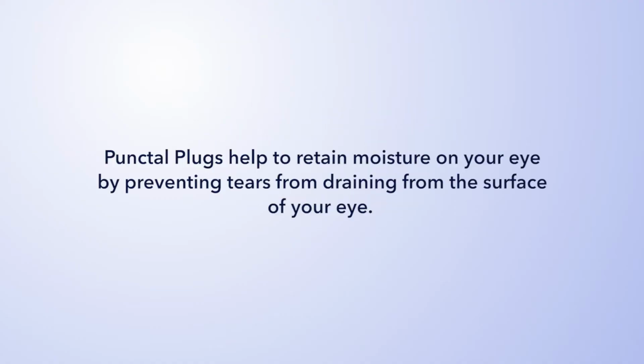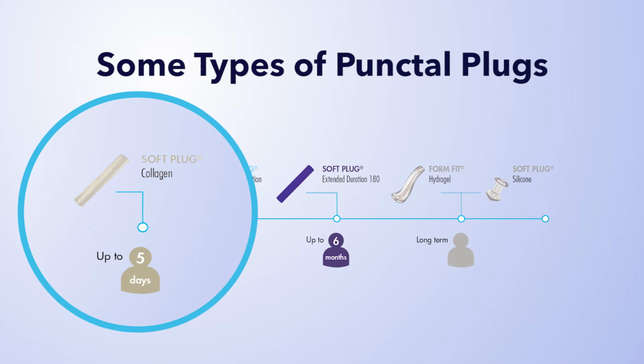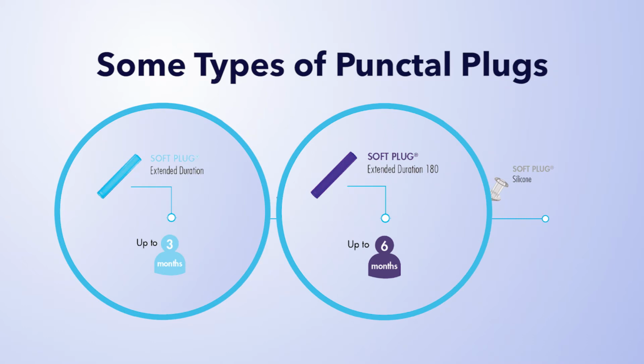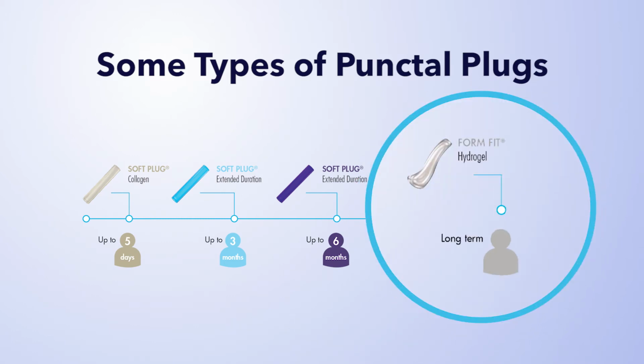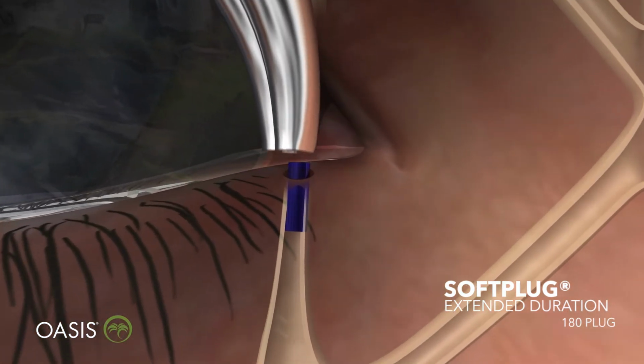So now we are going to decide on what plug is the right fit for me. Plugs fall into different categories. We're going to say short-term. A collagen plug would be a short-term plug because it lasts up to about 5 days. Then there are absorbable or dissolvable plugs, and those can last 3 months or 6 months. There are also long-term plugs, and those can be silicone plugs and hydrogel plugs. So now we're trying to decide which of these different plugs would be the right fit for me. Based on my results in the diagnostics, I have dry eye, but it's mild. So I'm going to get extended duration punctal plugs placed in my puncta.